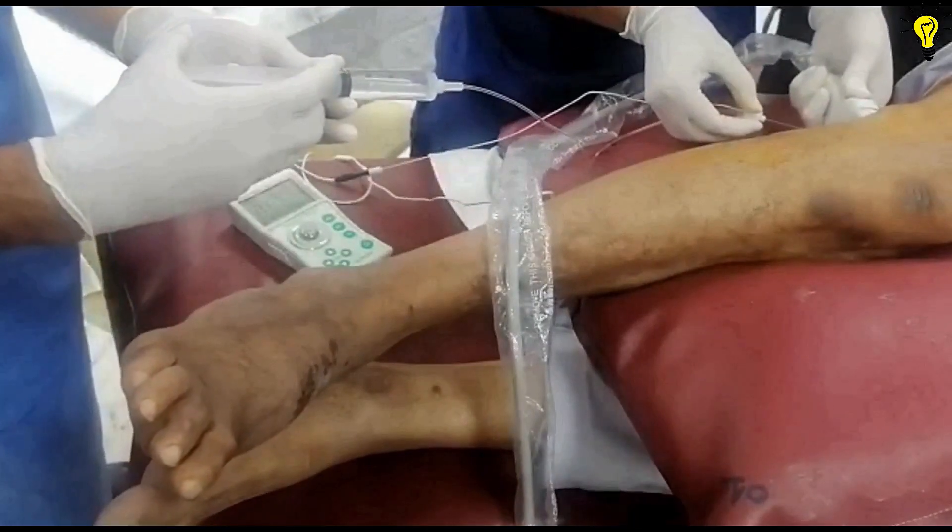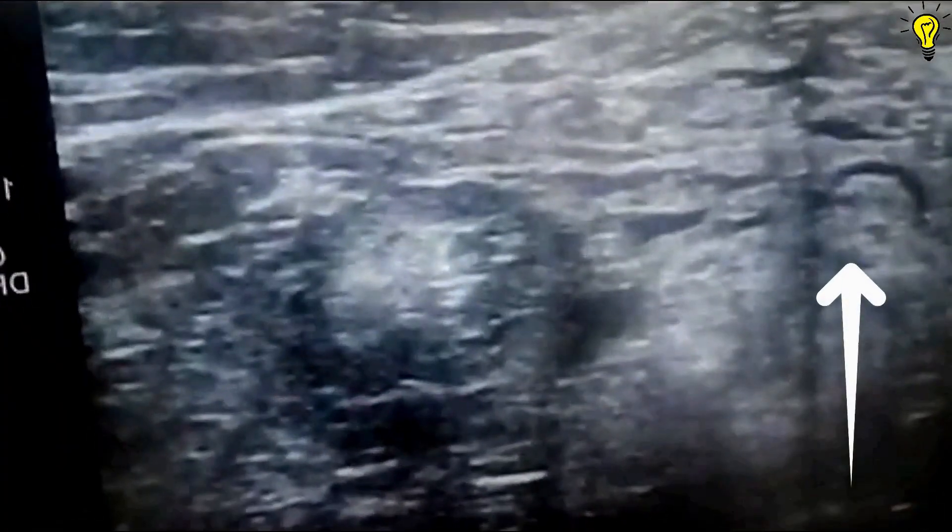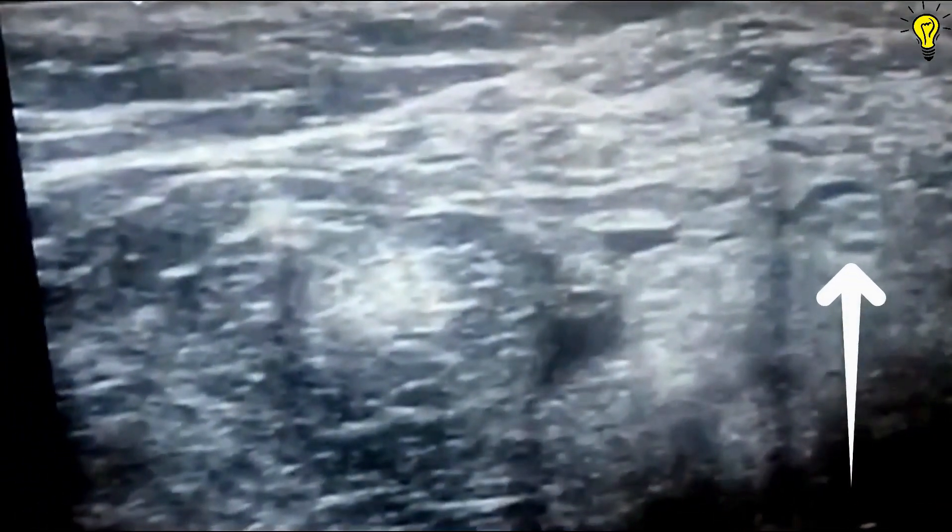Entering the needle, I target the laterally placed common peroneal nerve first. As I get closer to the nerve with 0.5 mA current, the twitch appears — this is eversion of the foot, which is the function of the superficial peroneal nerve, a branch of the common peroneal nerve. I then slowly withdraw the needle millimeter by millimeter until the twitch disappears. After aspirating, I give 10 cc of 0.5% bupivacaine. You can see the dark hypoechoic local anesthetic spread around the nerve — the nerve bundle getting pushed away and compressed.